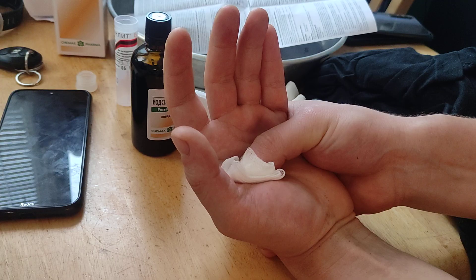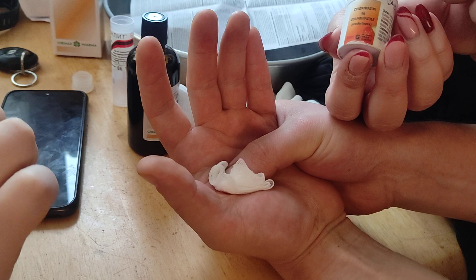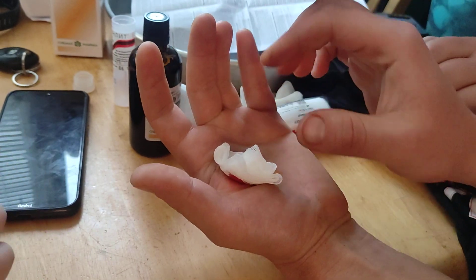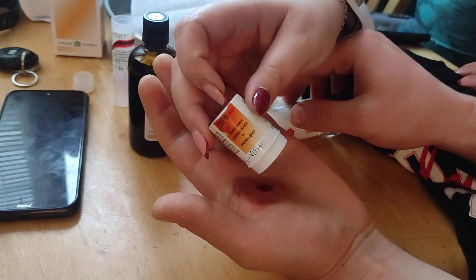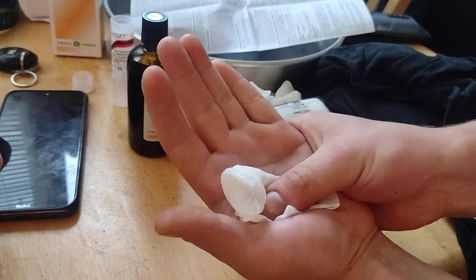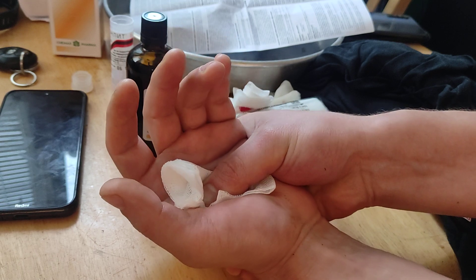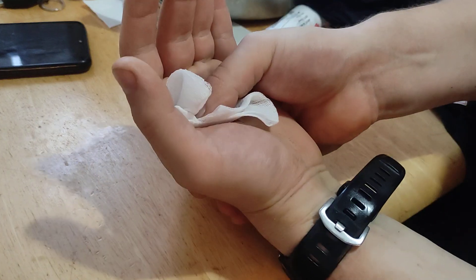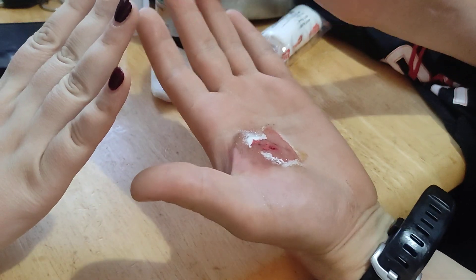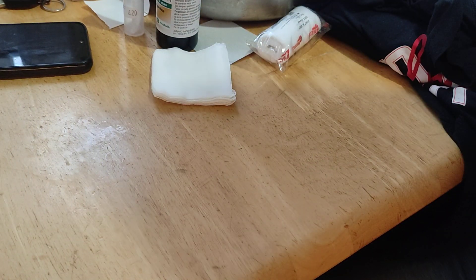So now we're going to use the powder, which is antiseptic, and it's stopping the blood really nicely. Prepare the next one — it actually starts even harder. Quick, quick, quick. There we go. Now I'll hold it for a while — this will definitely stop it. It's a lot better. So this is the stop-bleeding powder. I'll go and buy some more.